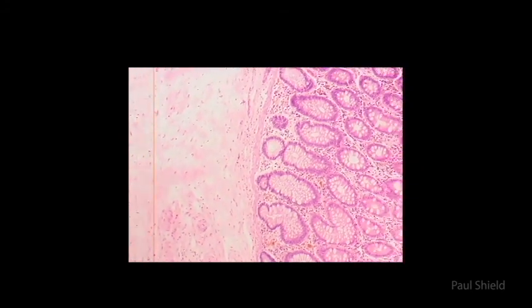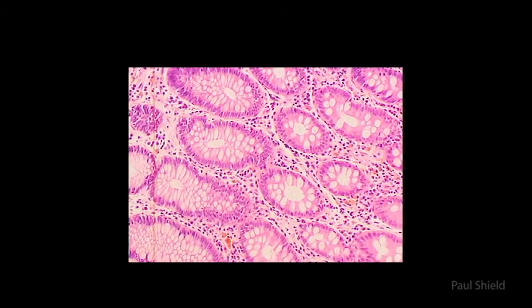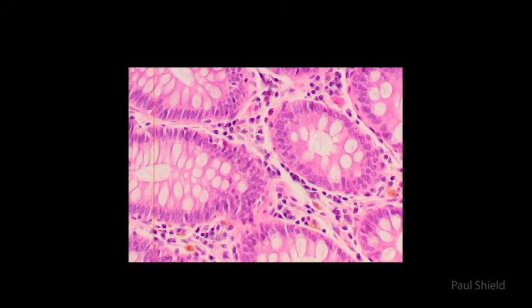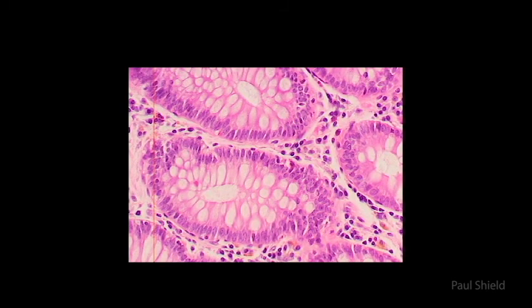So this is the biopsy. You can see on the right hand side normal colonic epithelium, underlying connective tissue, a bit of a high power. You can see the goblet cell, morphology of the columnar cells. It's a simple columnar epithelium, all the nuclei arranged down along the basement membrane, and there's a bit of a lymphocyte infiltrate in between those glands.